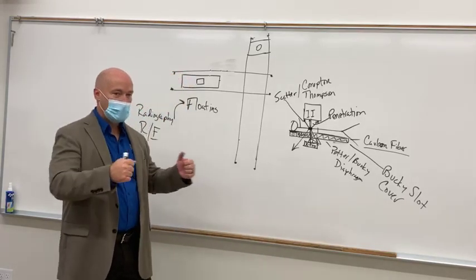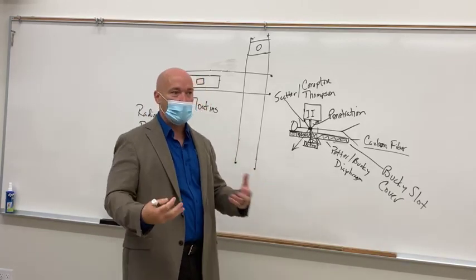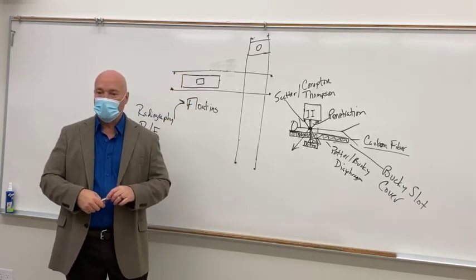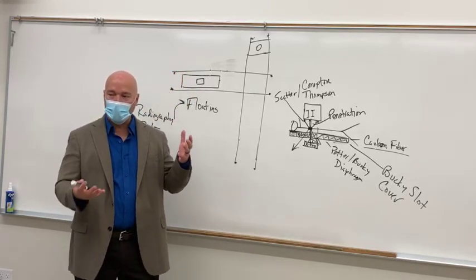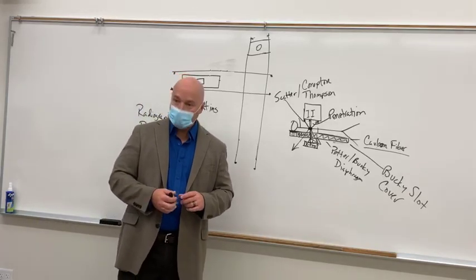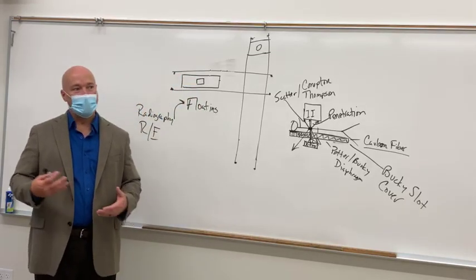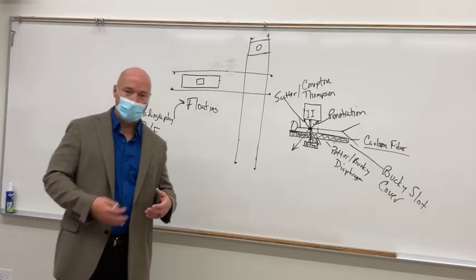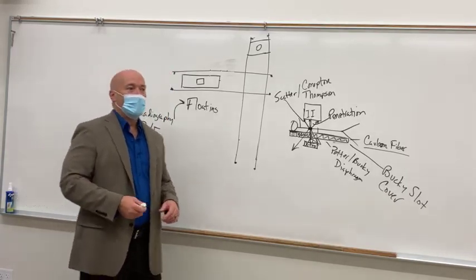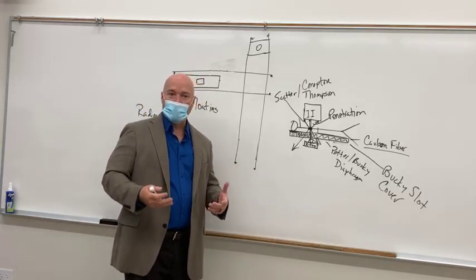So you put the footboard on the table and jerk on that thing just as hard as you can for just a little bit, because it's got to lock into place. And if you put it on and it doesn't lock into place, and then you stand the table up, but there's not enough weight on it for it to fall off, the patient steps on it, it's going to hurt them, right? It might fall on their opposite foot. If it's an older patient, they put enough weight on it, they're going to fall into the tower, bash their head. It's just going to be ugly, right? So put the foot on it and pull on it real hard to make sure it's locked into place good.